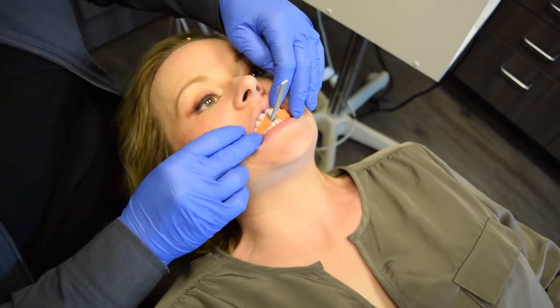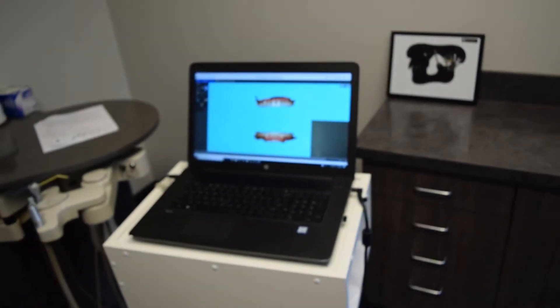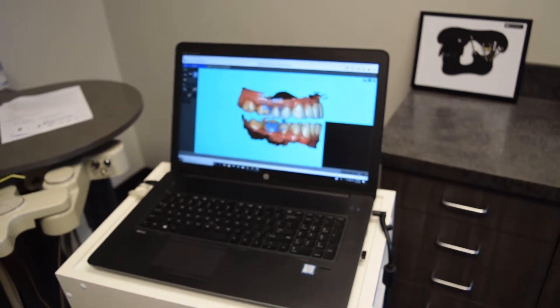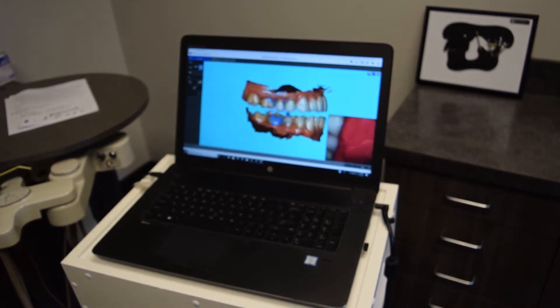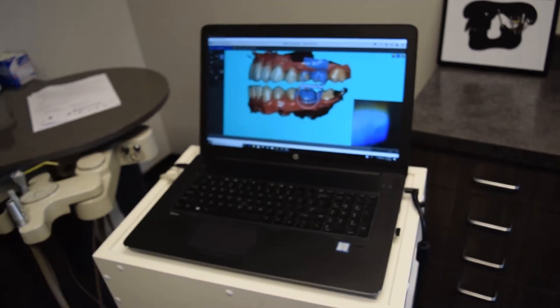We can take the scanner and make sure the patient holds their teeth together and not open. I'm going to try to focus more on the screen over here. You can see the bite is starting to come together — she's captured the bite here. She'll keep the teeth together and do the same thing on the other side. And once that's captured, we have our bite here — you can see we got it captured. It makes a very stable way to do this.